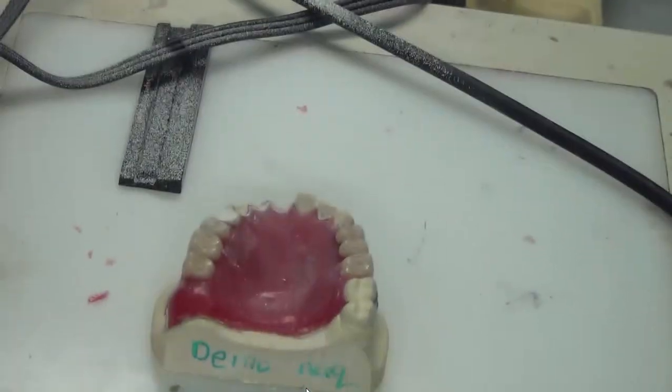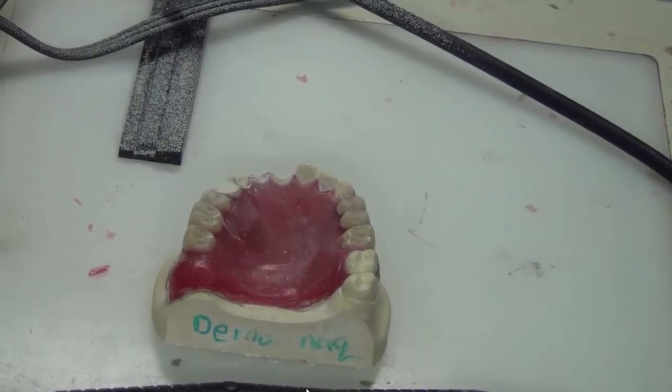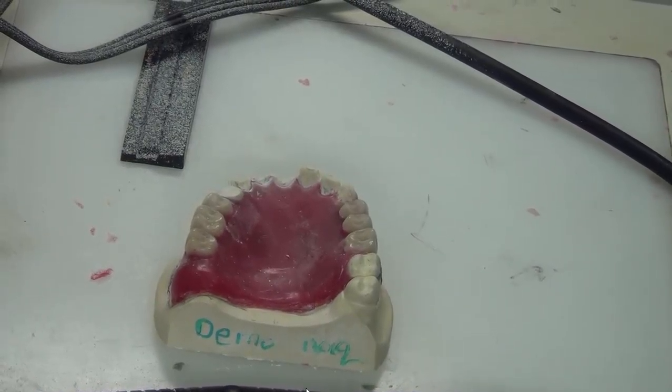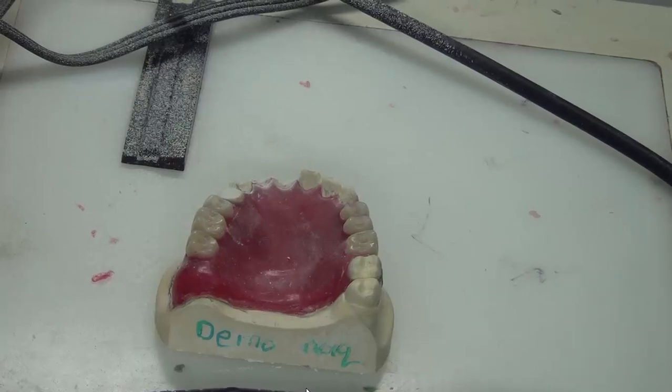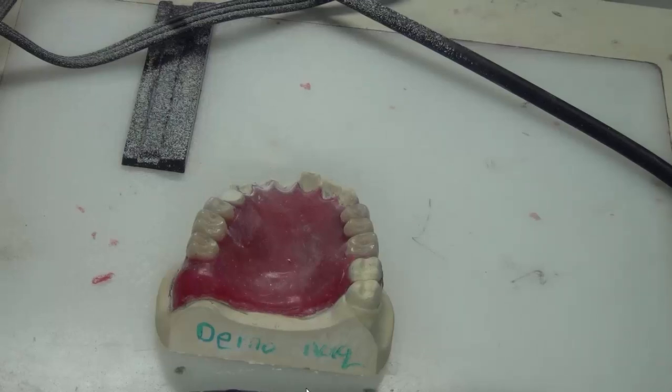So just to revise it, step number 1 is to make sure it's sealed all around. Fix your clasp, make sure your clasps are in the correct position and put super glue on them. And then cut off the natural teeth over the cingulum, inclined buccally. Can you please begin now? For this step, we have 10 minutes.